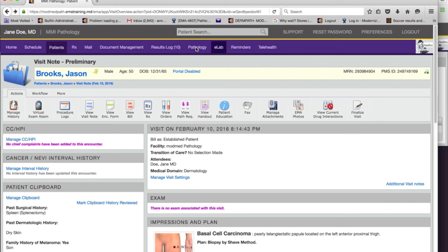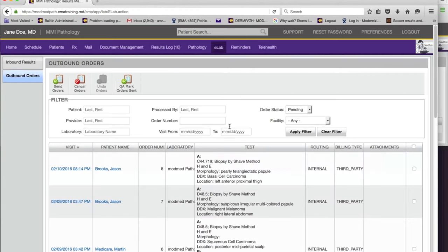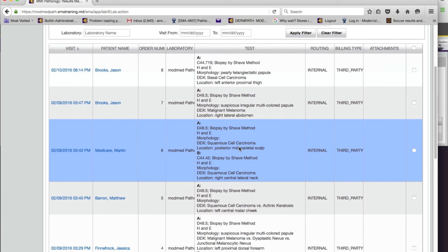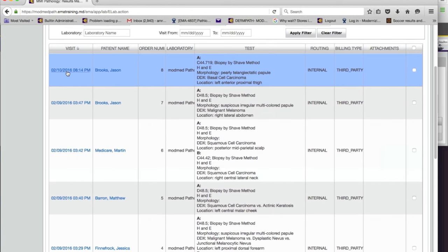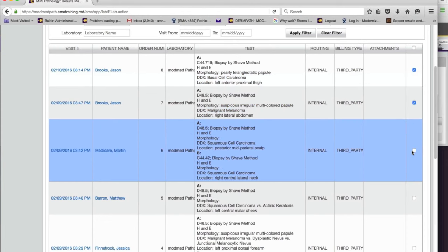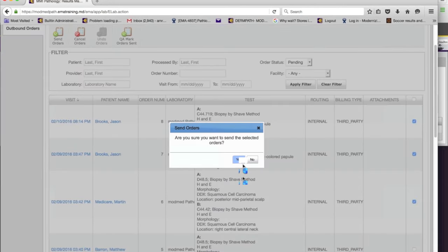Let's go back to the module. Once you create a requisition and save the note in EMA, everything goes to the eLab tab under outbound orders. Here are all the requisitions — this is the one I just did plus the others I created. This is the last place where the MA or nurse responsible for sending requisitions with specimens out can come in and make sure everything is correct. They can go to the visit and change things if something isn't correct. To route these to the module, you select the ones you want and say 'send orders.'